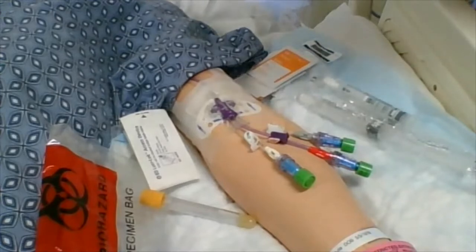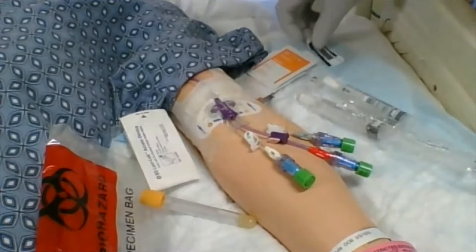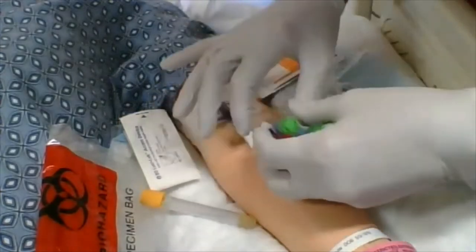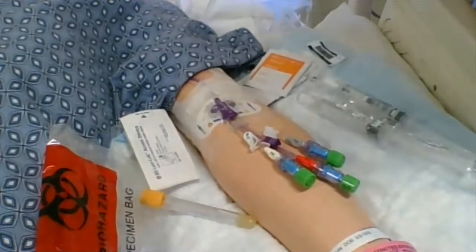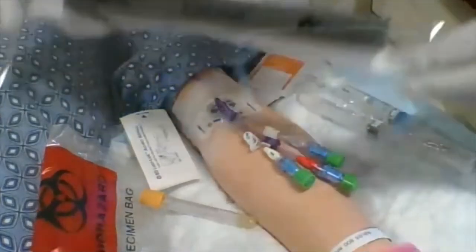The first thing you're going to do is collect all the equipment you'll need to draw your specimens, including a biohazard bag, a couple of 10 ml syringes full of saline, your specimen labels, some extra clean brand new Kuros caps, alcohol wipes, and your PPE — including a nice visor to protect your eyes.